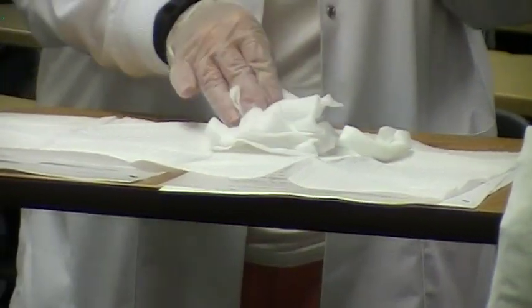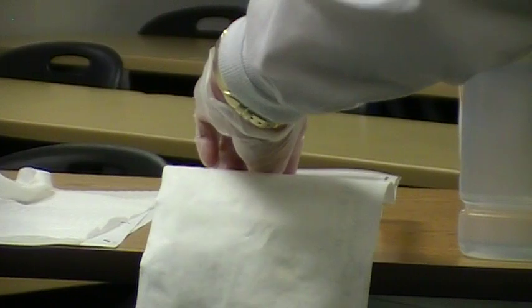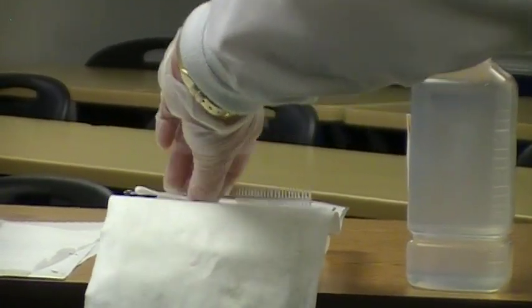And you can separate them out if you need to, depending on what your physician is doing. If you wanted to place all of the gauze. And again, you see how I move around the table. Also in my box, I have some pipe cleaners. So again, I'm going to go around, grab that without crossing over my sterile field. If I needed to, I could even go in front of that to place those, or again, back over here.